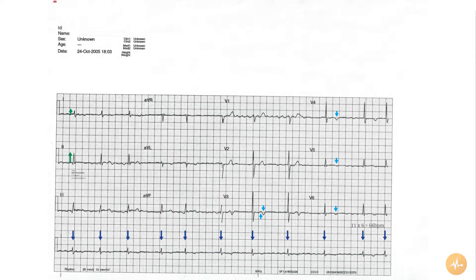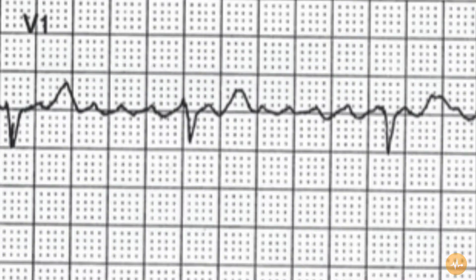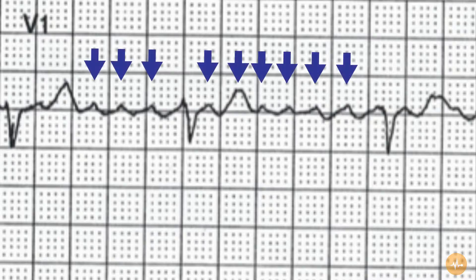One final note. The baseline in lead V1 shows what could be misinterpreted as organised atrial activity, in the form of flutter waves. However, the waves are not large enough and not regular enough to be convincingly flutter waves, and these are probably just large fibrillation waves.